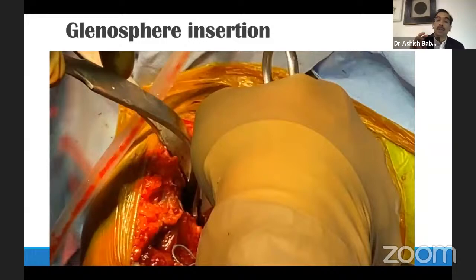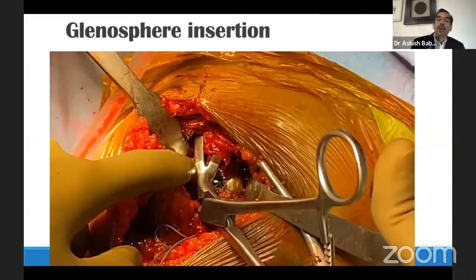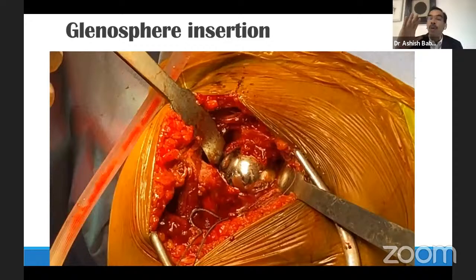As your glenosphere goes in, do remove that Y retractor, because that prevents the glenosphere from going into its home position. And then gently remove your holder and bring in the punch and knock in the glenosphere. Glenosphere prostheses that have a cannulated hole will not accept the screw unless it is in its home position. So that's a good thing for those prostheses, but this is a Biomet Comprehensive and it doesn't have a cannulated hole. So you don't want to fix it in eccentrically.